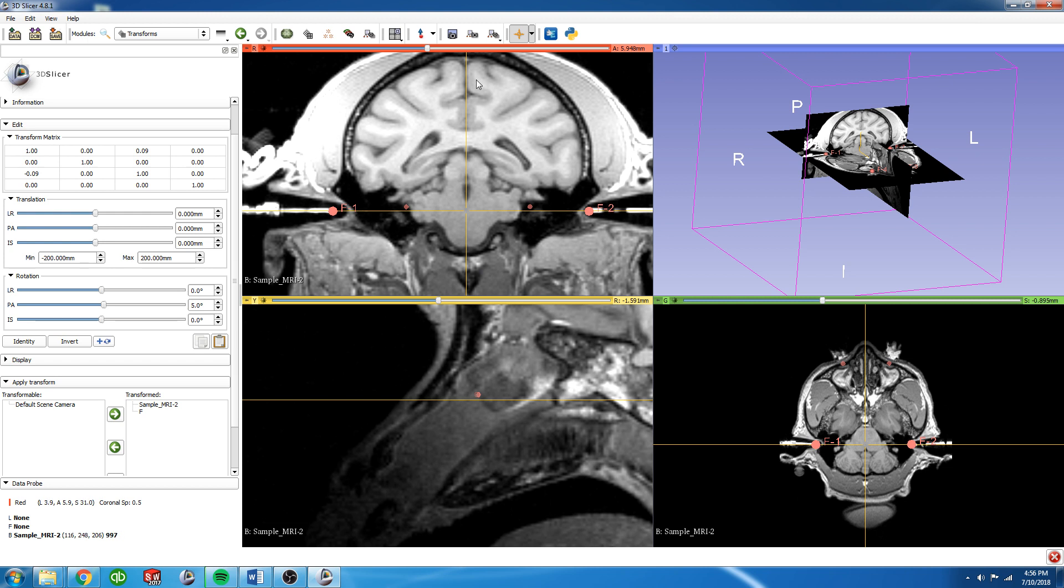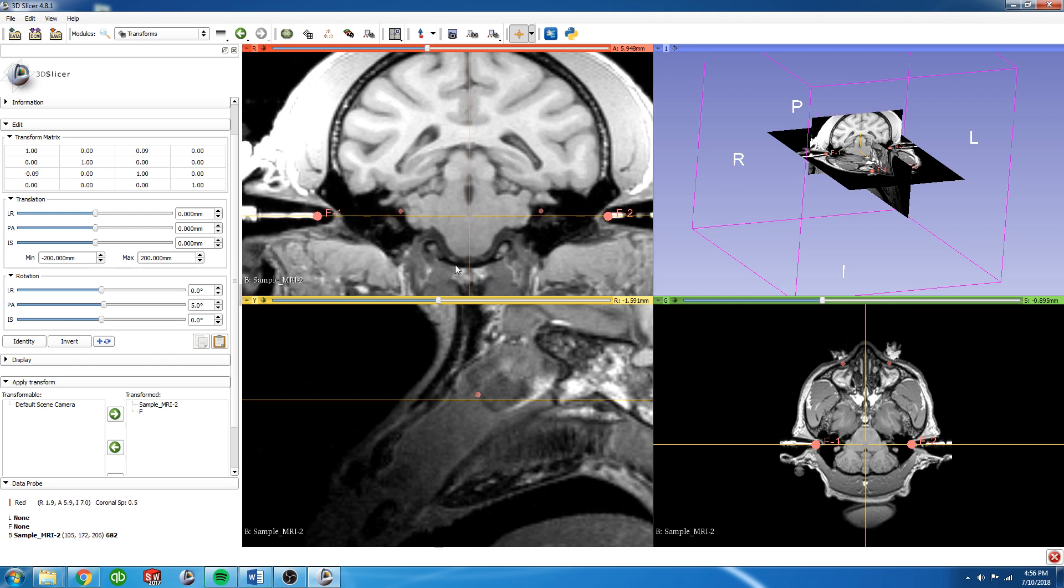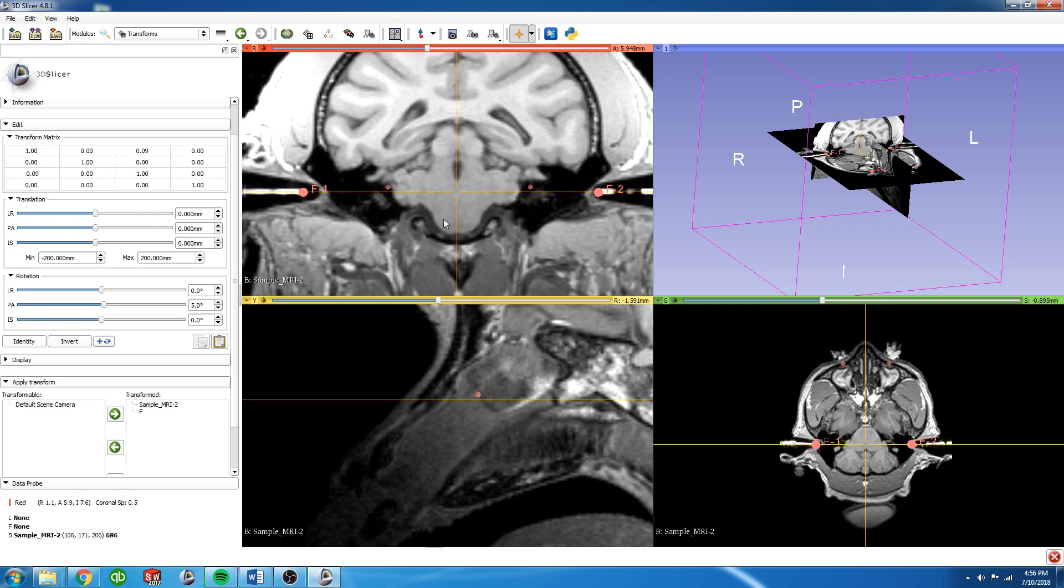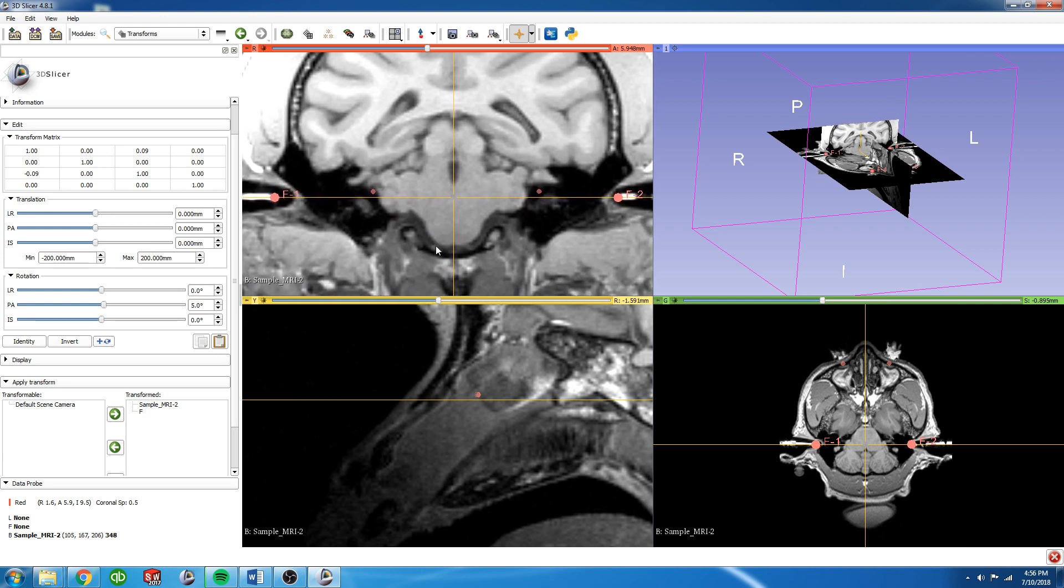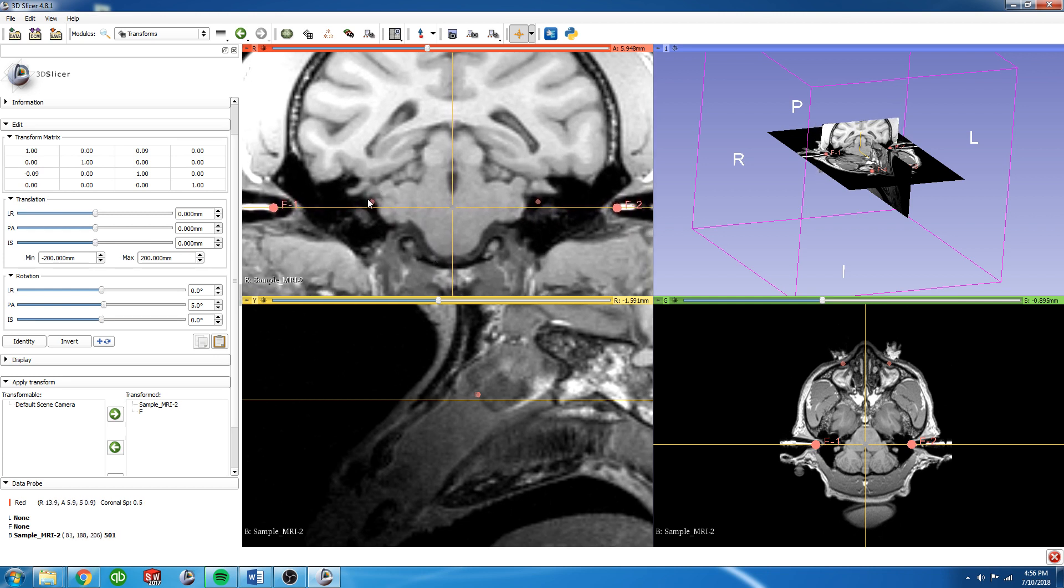You can see that this is pretty well aligned as well. The midline is pretty well aligned. So all we need to do now is get this forward back tilt so that these fiducials intersect this line.